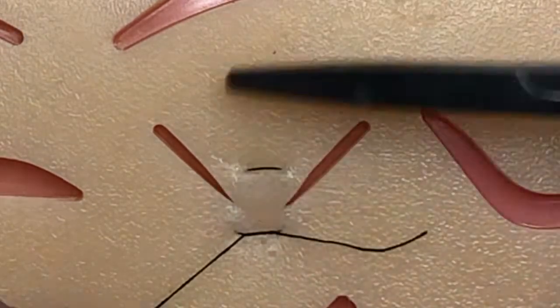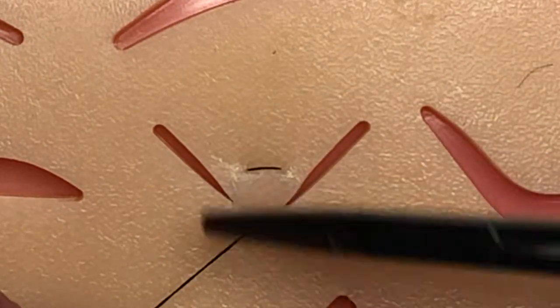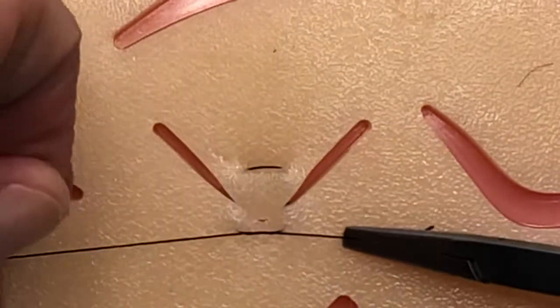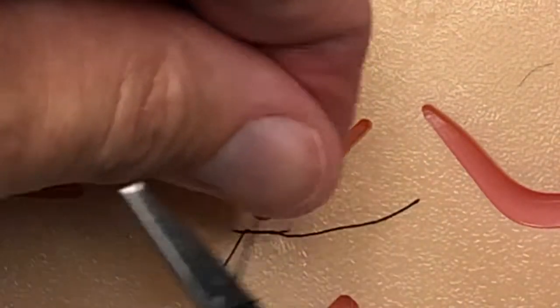You can see here how that tension is distributed across two different sutures that are going through the tissue out and across and back through. So this really just helps distribute the tension across the wound. Less likely for strangulation.